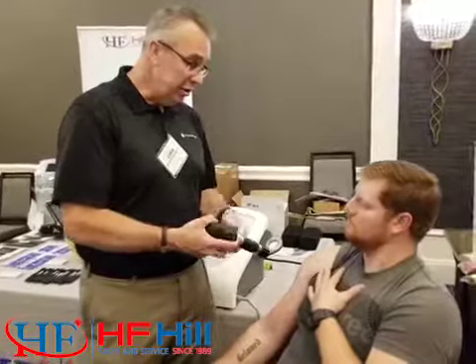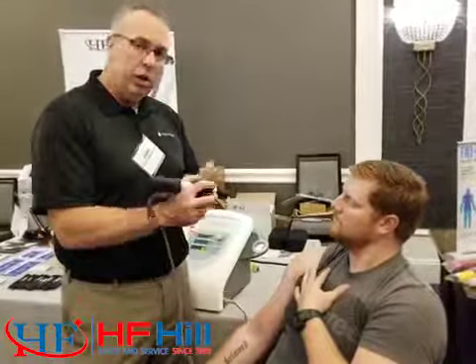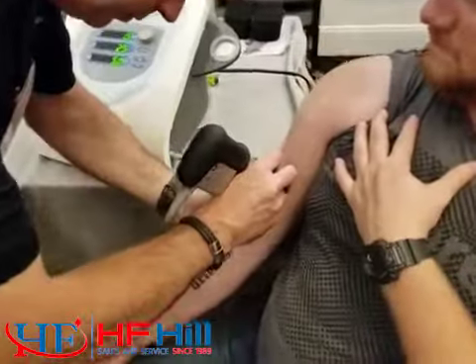So I could actually use this if part of his impingement problem is the long head of the biceps. From a motor point standpoint, I would probably want to treat his whole area, and I could actually work the bicep muscle.